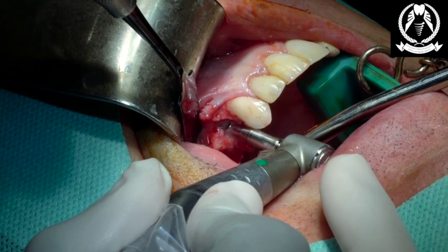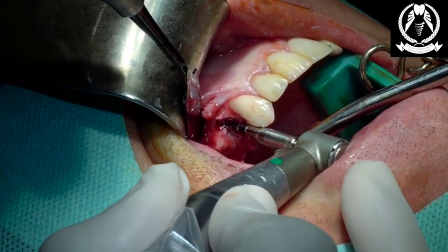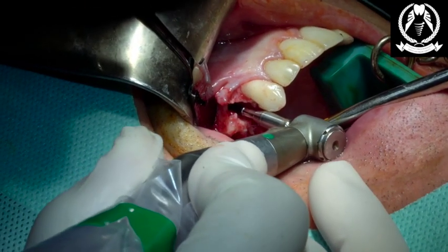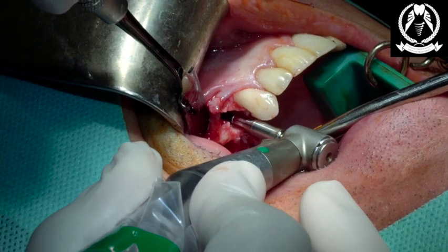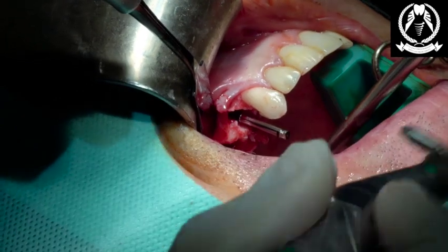And then we're going to countersink a little bit more. Cool. So there's a 2.8 drill. Really don't want to do any more than that. Checking where the crestal position of that implant is going to be. I'm quite happy with that. Open wide, Alan. That's where we're going to be.